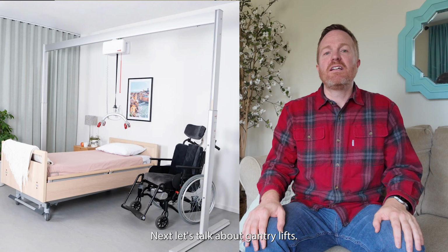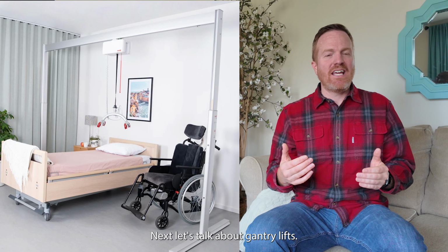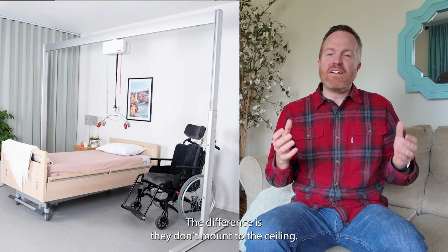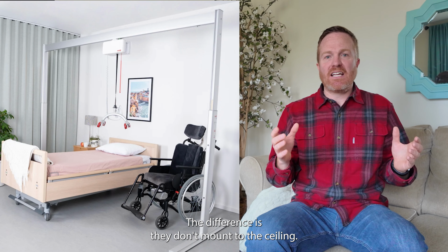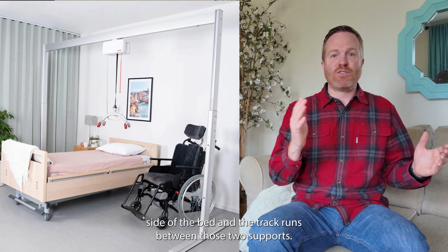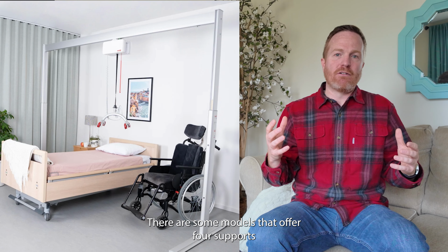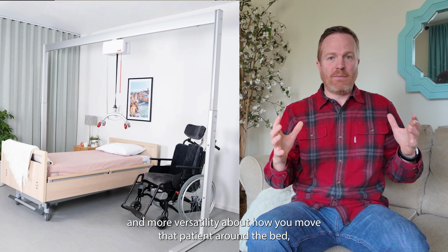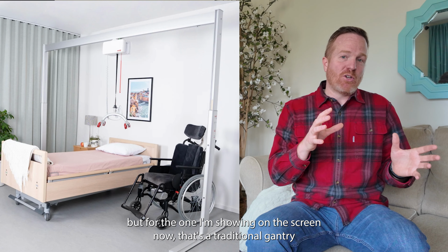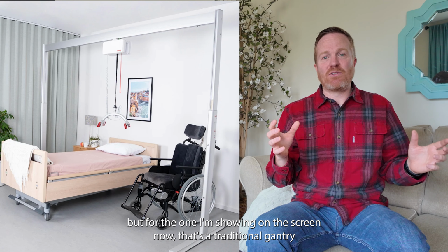Next, let's talk about gantry lifts. And gantry lifts operate a lot like overhead ceiling lifts do. The difference is they don't mount to the ceiling. Instead, you have a support on either side of the bed and the track runs between those two supports. There are some models that offer 4 supports and more versatility about how you move that patient around the bed. But for the one I'm showing you on the screen now, that's a traditional gantry style lift.